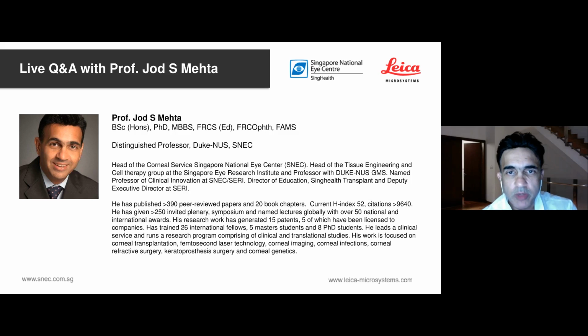For more experienced surgeons, you will be able to push the kind of cases you can do, DMEK surgery for example, and next time you'll hear about DALK surgery. That will really allow you to do much more complicated cases that you probably would otherwise not have been able to do if you didn't have the information, and it will guide you.